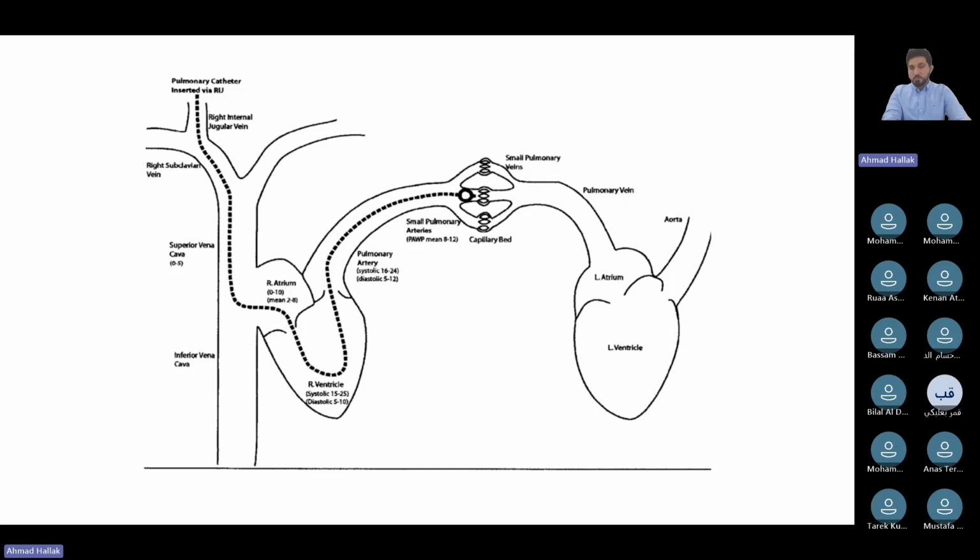So this is the gold standard for volume, the left LVEDP. And the left atrial pressure is the same as the PA wedge pressure. When you have occluded the pressure proximally, then the pressure sensor at the tip of the pulmonary artery catheter is sensing this pressure. So this is the easiest way to get the LV end diastolic pressure. And it correlates well with when you do a left heart cath and you do an LVEDP directly, remeasuring the LV end diastolic pressure. It correlates very well with this, as long as there's no significant valvular disease or other pathology that could cause this.